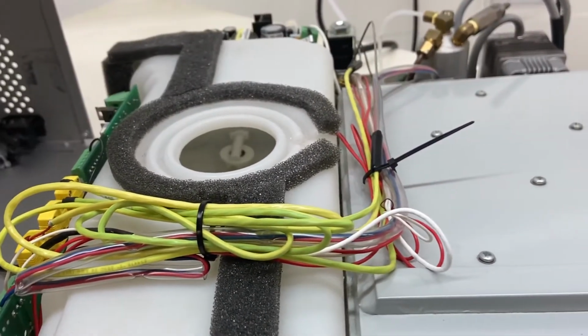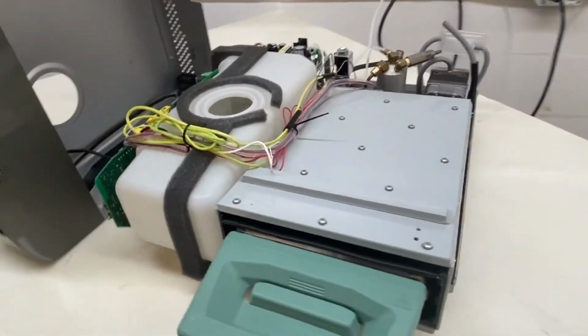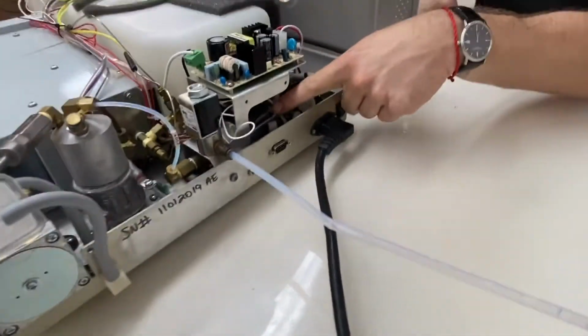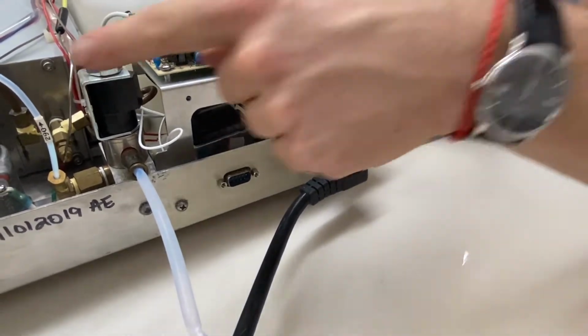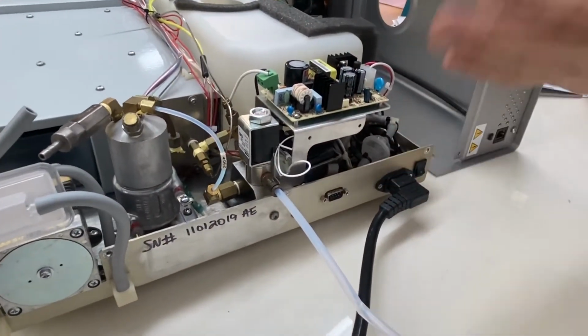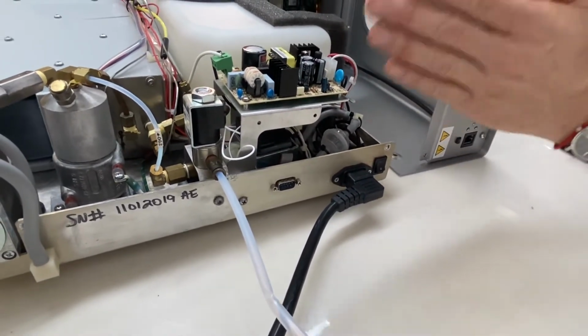Next, we are going to check the pump using pump tester bottle. So we're going to go to the back of the machine and we're going to look right here. This is the water pump. To check it with the pump tester bottle, you will have to come here and disconnect this. This is something I probably don't recommend to do. Give me a call, 704-966-1650, if you want to know how to do that.